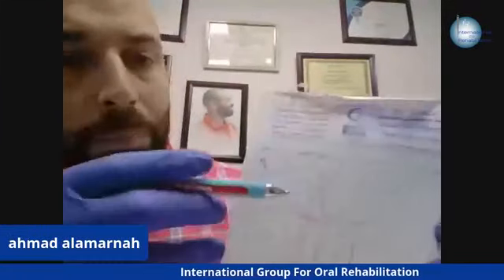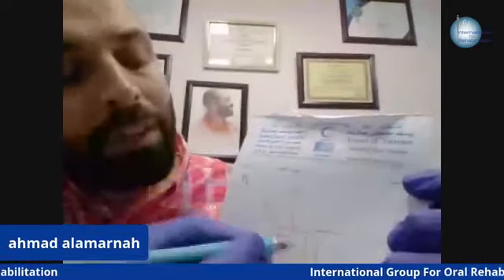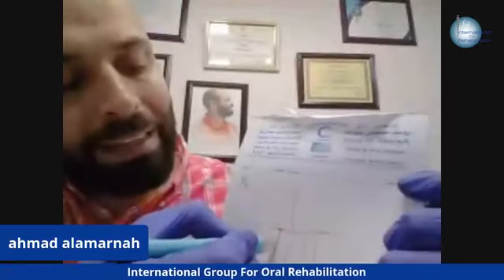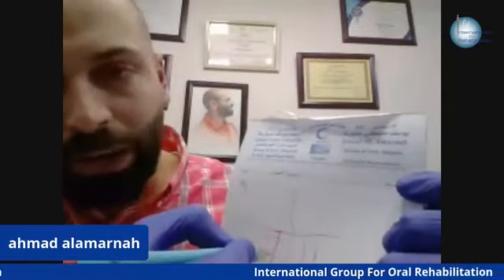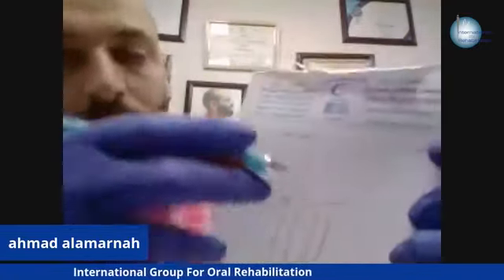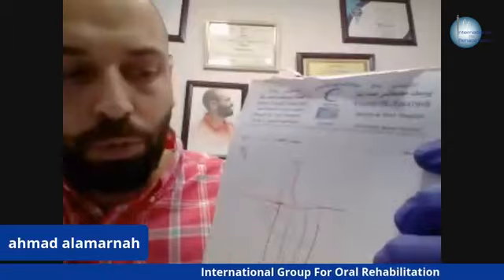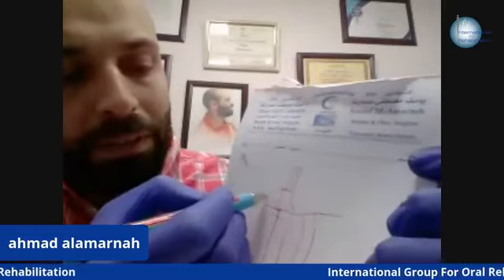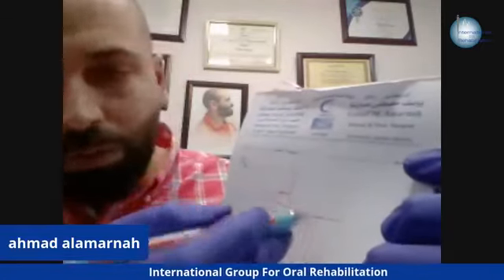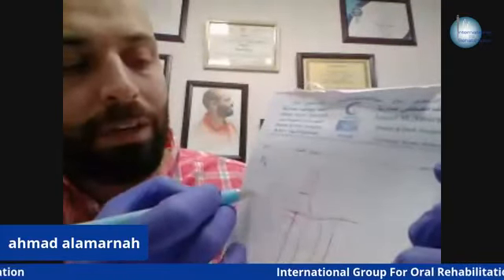Okay. Let's say this is a tooth that you are going to build with a post and core, okay? With a fiber post, and you can build it. So the recommendation is below the cement to enamel junction, at least 5 millimeters of preparation for the root canal, okay? This will be enough for retaining the fiber post and will have all the physical properties that you need. So there is 5 millimeters here, and for the ferrule effect, at least you have to have 2 millimeters. Okay, less than that is not enough. You need crown lengthening, and so on. So you have to have 2 millimeters. Combined, it's 7 millimeters.